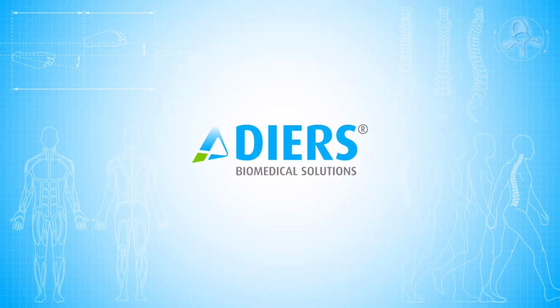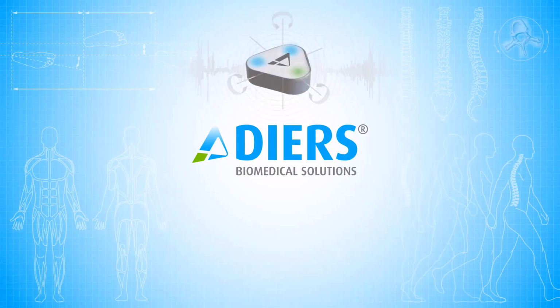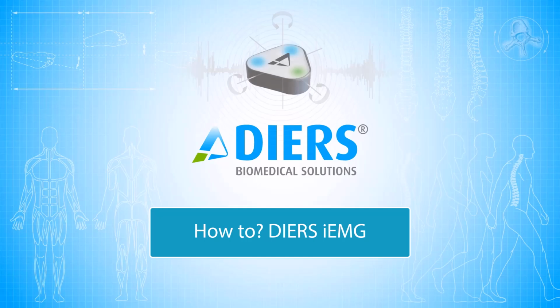Welcome to Module A of the DIERS Online Academy. In this video, we will look at the DIERS iEMG and the question of how to measure correctly. In detail, we will go through patient preparation, measurement procedure, and analysis with regard to post-processing of the measured sample.